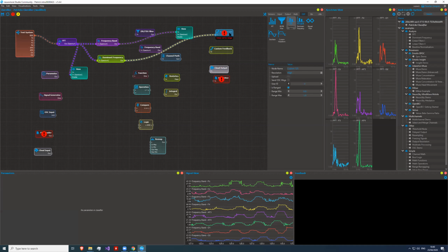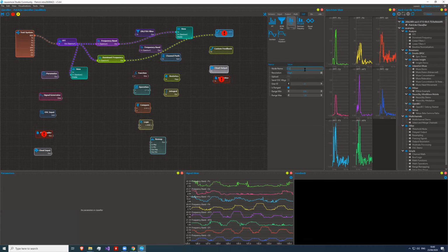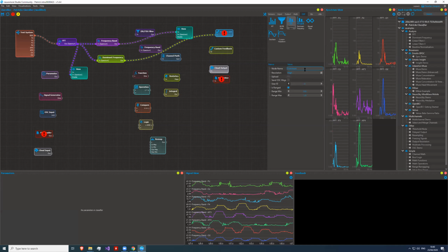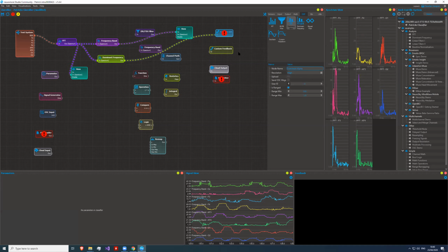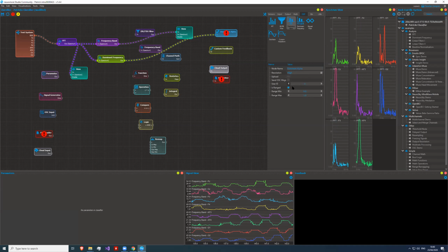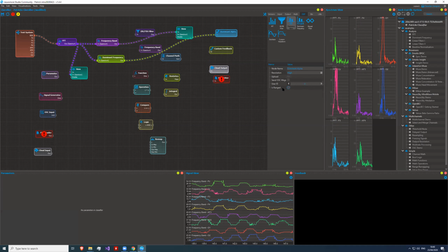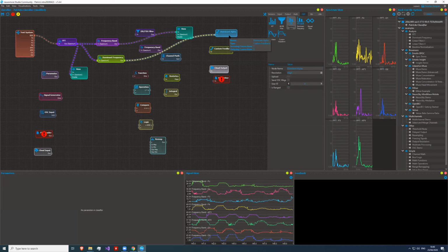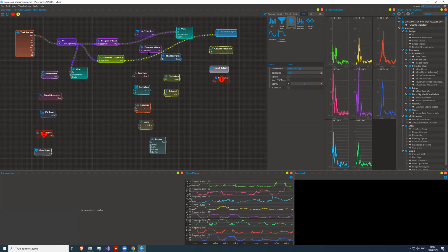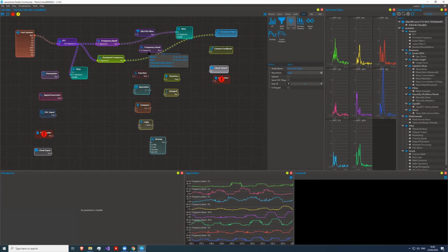So that particular node now would be dominant alpha. And the node says, oh, value not in range, you know? So we said that the output is range between 0 and 1, which is not the case. So we just remove it. Now the classifier is happy again.